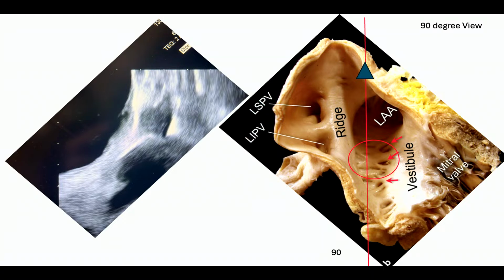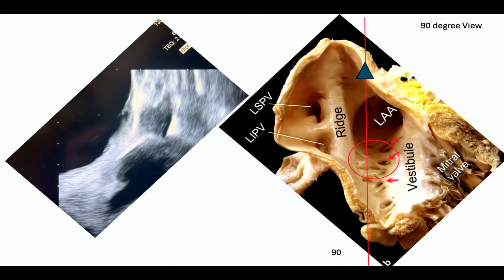This is, to me, if I have to choose one view, I agree that one view is not good as no view, but if I have to choose, this is the one that has the most shoulder, because usually it's the floor of the appendage that has a hole because the mitral valve is in there. The roof, you always have a roof. The Coumadin ridge extends pretty deep in, and the septal part is a very good anchor there to the mitral, but the floor right here that I show you here is where usually the shoulders are.